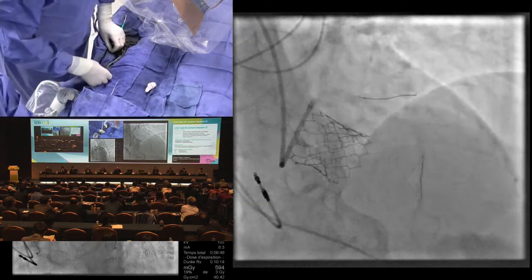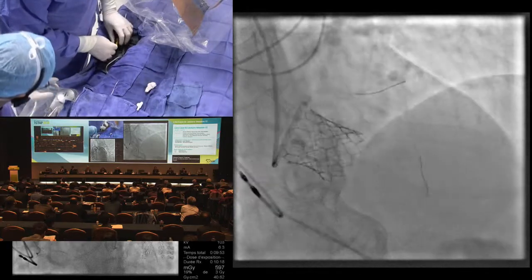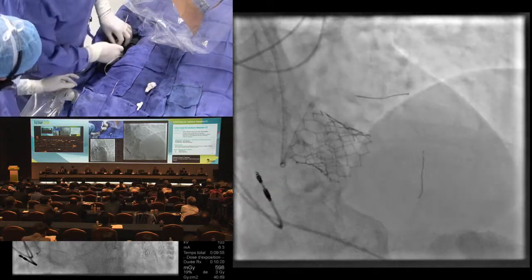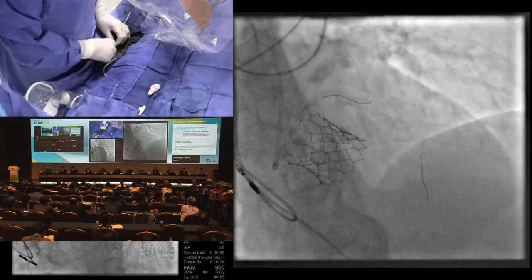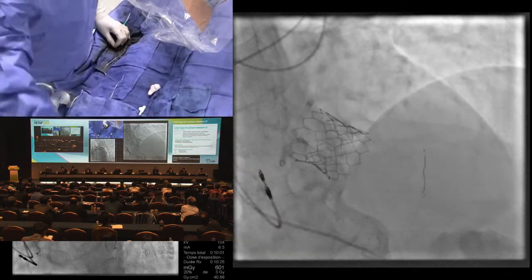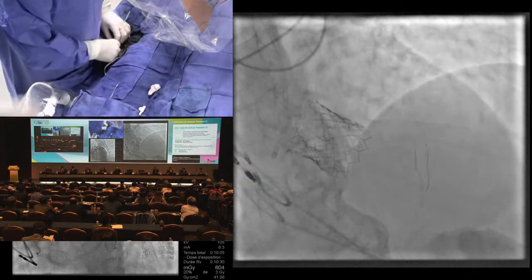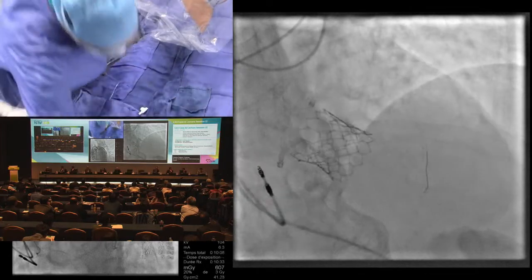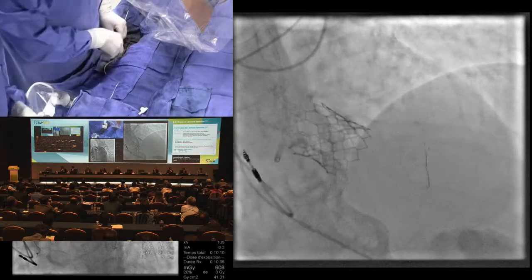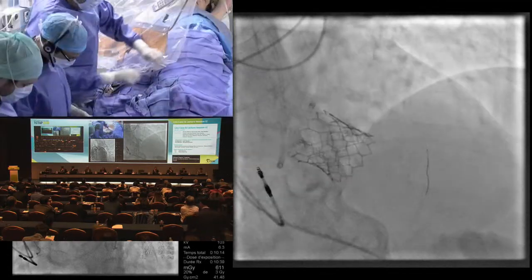We wire here. And now, at that time, I have to remove first the introducer here. Second, the side wire. I will remove the side wire. Okay. And now we advance the 1.5 millimeter burr for the left main LAD. Okay, we'll do it like that. Very nice.